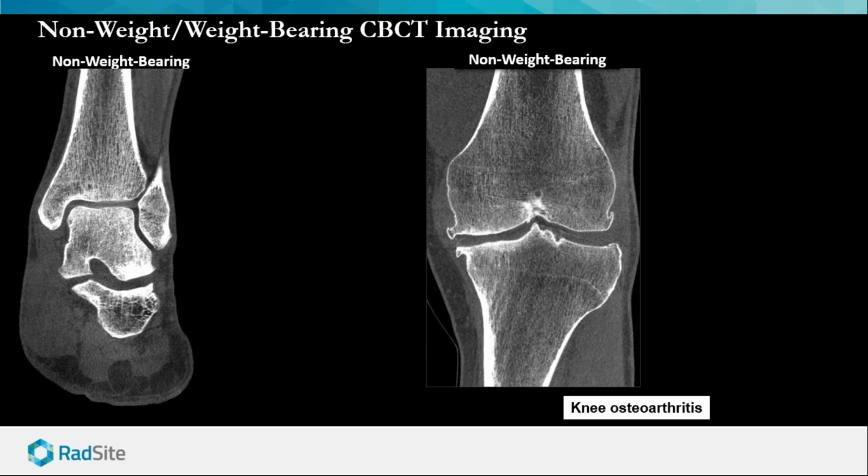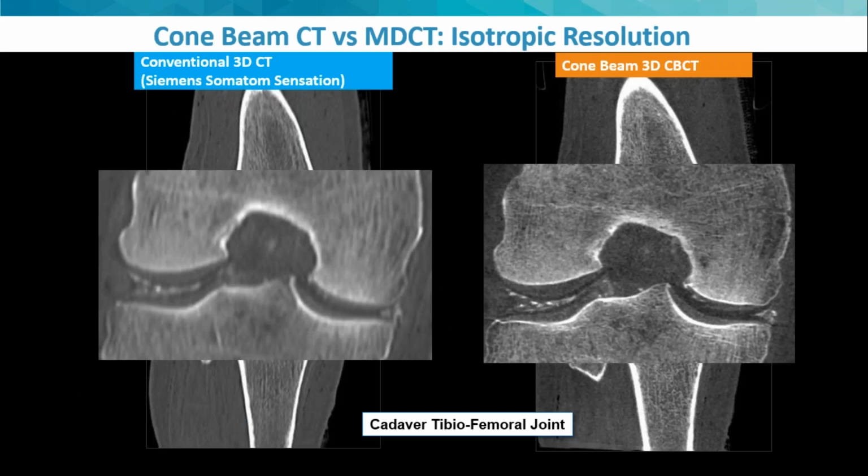So, Ian, could you just, I'm sorry to interrupt, but could you just translate a couple things for us? In one case, you're talking about 15 to 16 line pairs per centimeter. How does that translate to slice thickness for a CT? So if I were doing a CT protocol in a patient and I were doing the knee, what is the equivalent slice thickness? I would estimate it's maybe around 0.3 millimeters, but can you tell me approximately if I were doing reconstructions in, say, the axial plane, I would be able to reasonably do reconstructions at what slice thickness if I'm trying to compare one with the other? So your eye for detail is very accurate, Dr. Siegel.